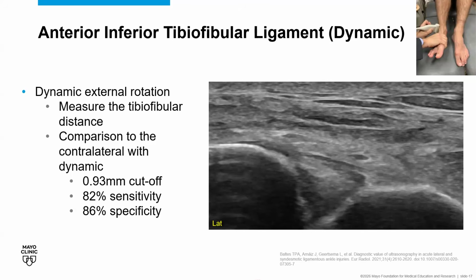But in that view, you can see two distinct bands, which gives a good image of the structure. Be aware that it can remain intact, which is why you may sometimes have more stability, or it can get torn as well. That was the only added information I wanted to bring in. Otherwise, I'll see if there are any other comments or questions.